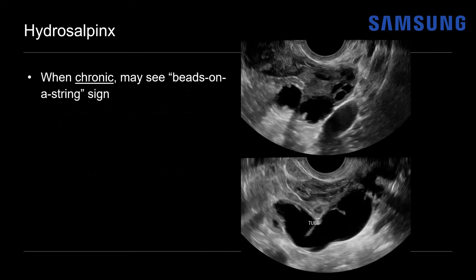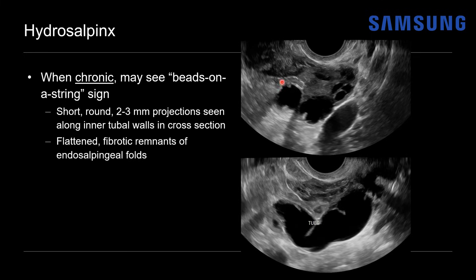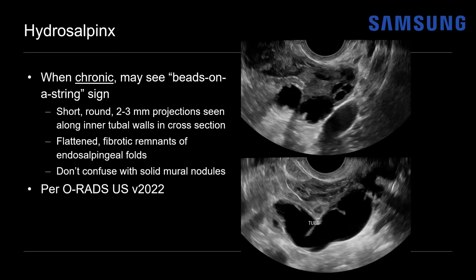When chronic, we may see the beads-on-a-string sign — short, round 2-3 mm projections along the inner tubal wall seen in cross-section, corresponding to flattened fibrotic remnants of the normal endosalpingeal folds. Don't confuse these with solid mural nodules in ovarian neoplasms; these are much smaller at 2-3 mm and often uniformly spaced. Per ORADS, no additional imaging follow-up is specifically recommended for simple hydrosalpinx; management follows gynecologist recommendations based on symptoms and clinical history.